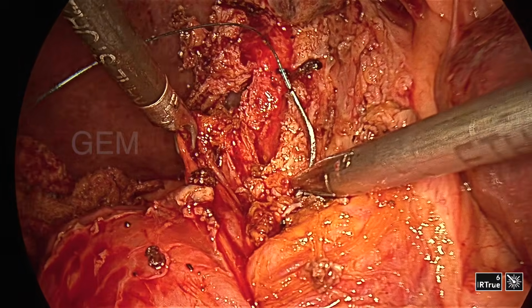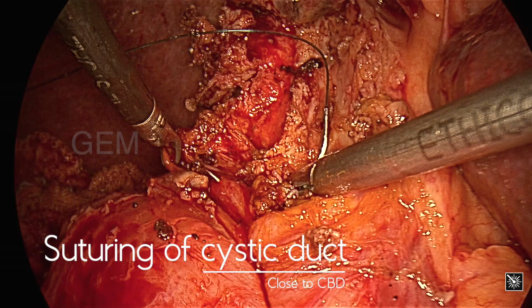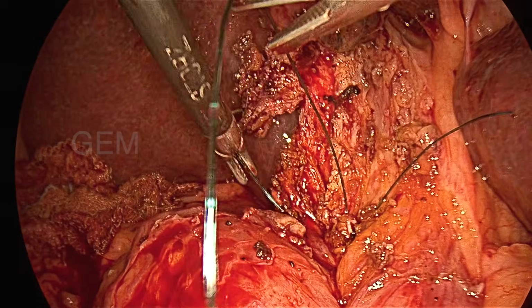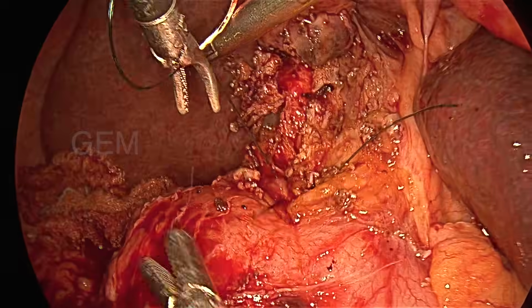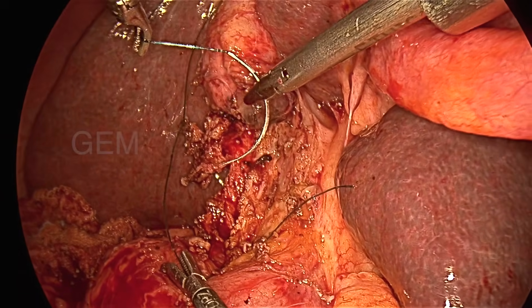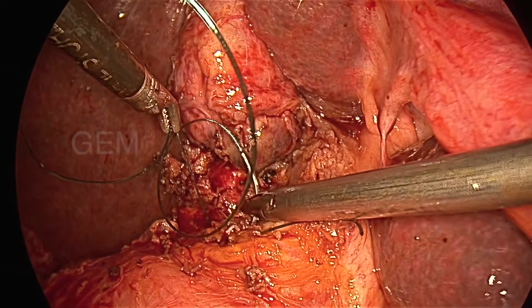So now I put IR mode. My PG is so happy, and he is making this mode. With the one button in the camera head, they can make this mode. So frequently he is doing this ICG mode and then checking it out.